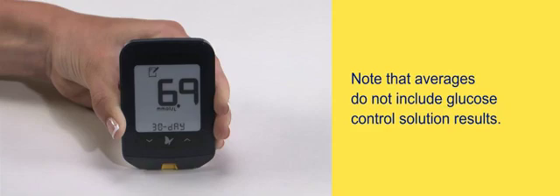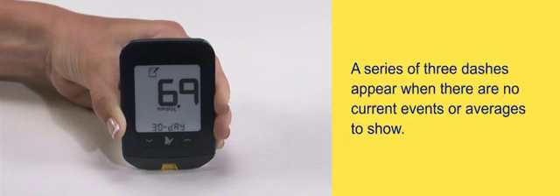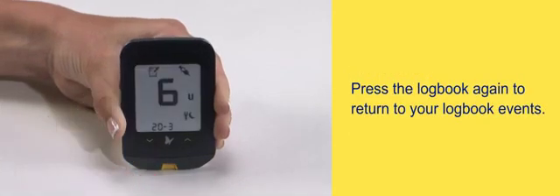Note that averages do not include glucose control solution results. Also keep in mind that control solution tests not marked as control solution tests may cause your averages to be inaccurate. A series of three dashes appear when there are no current events or averages to show. Press the logbook again to return to your logbook events.